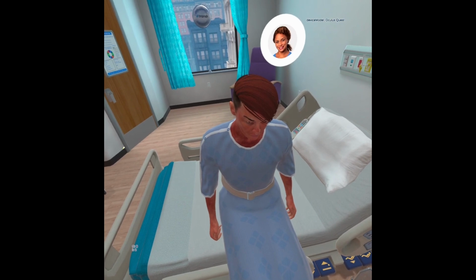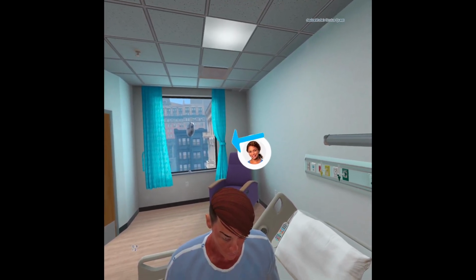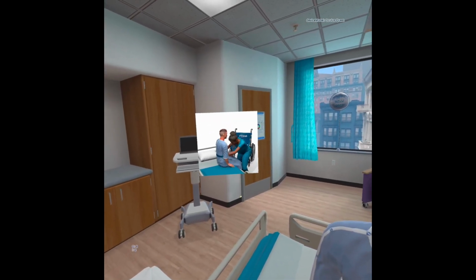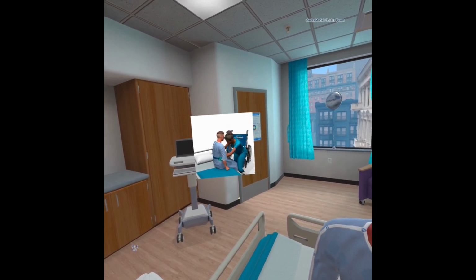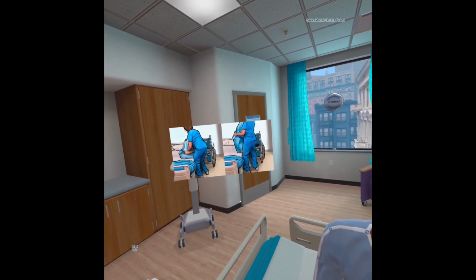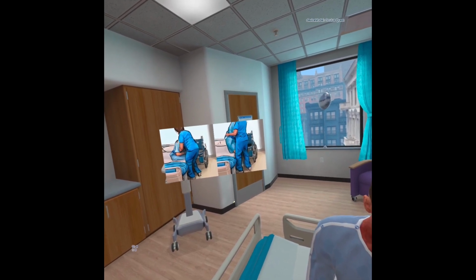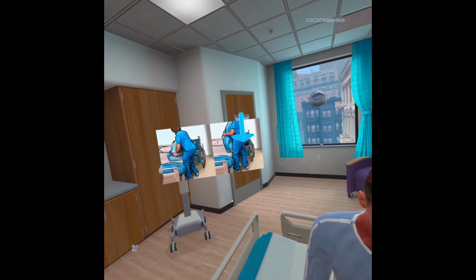We need to make sure our body mechanics are correct during this interaction to prevent injury. Note the starting position of the healthcare provider and how they bend at the knees as they help the patient stand. Stand in front of the patient with your legs about shoulder width apart. Your right leg needs to be positioned between the patient's legs so you have a free leg to help control the movement. Position your legs now.